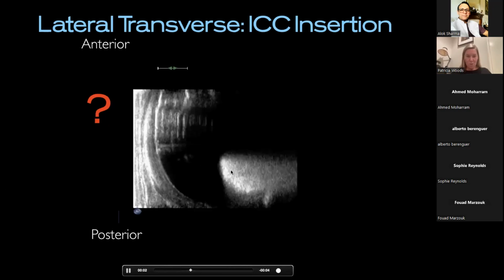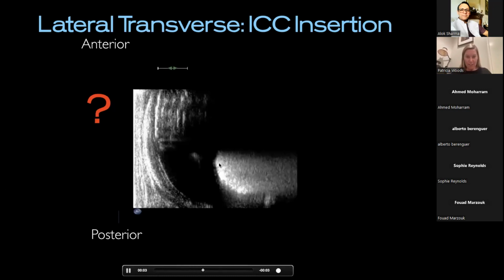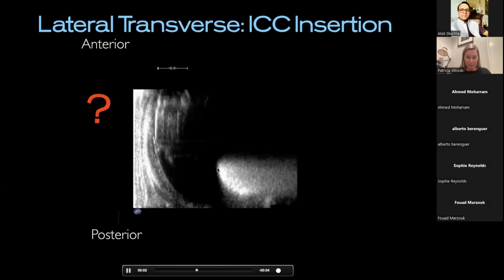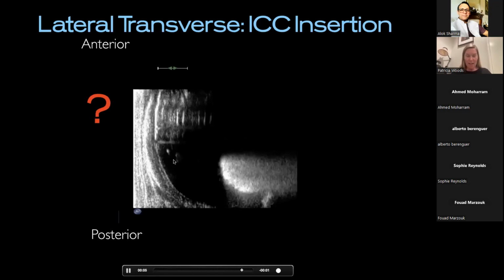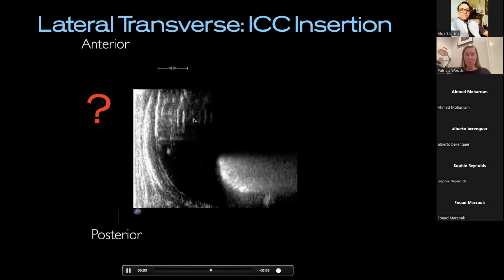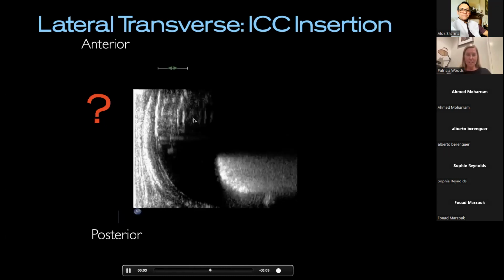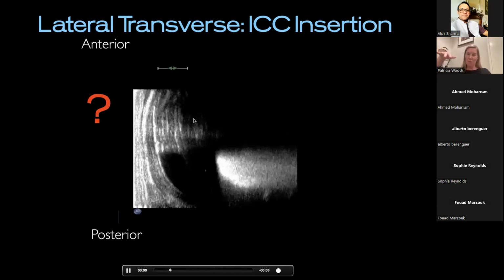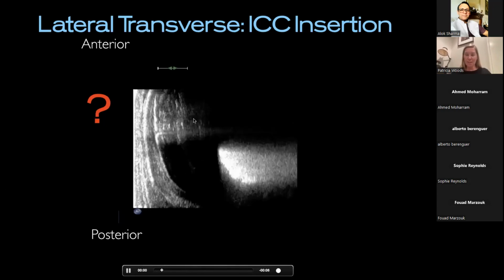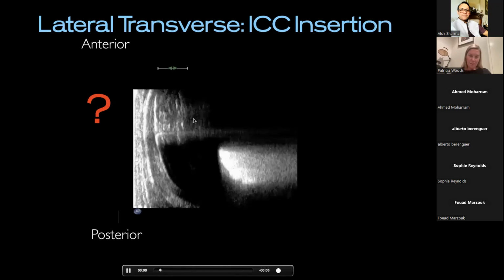So you are either observing a real-time air leak going on, but probably our fault, to be honest. I think it was just enthusiastic insertion. I think what we've done is pranged the lung, and you'll see these little artifacts bubbling up occasionally, and you're getting A lines. So you've got an example of how you can't diagnose behind air, even with a bucket of fluid behind it, and how it's rising to the surface, helping you with your orientation as well. But you're able to visualize pneumothorax, or whatever the word is for air and fluid in the chest. Yeah, so it's just a complication.